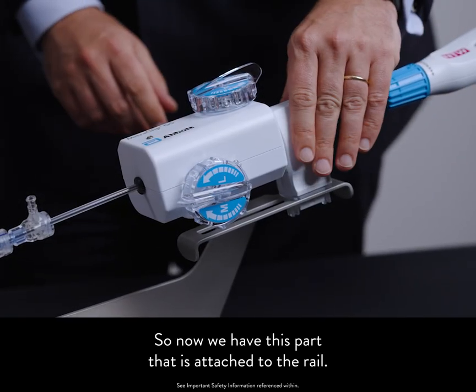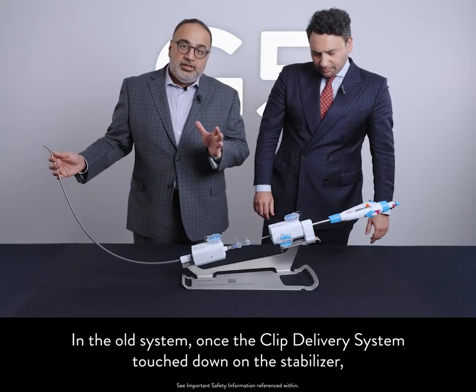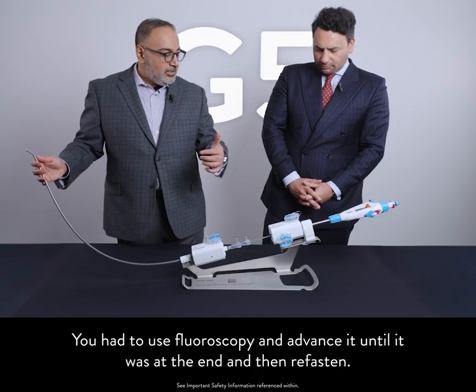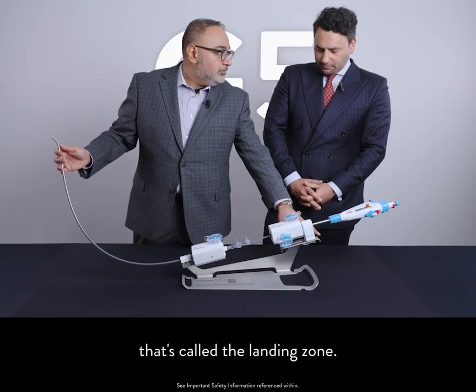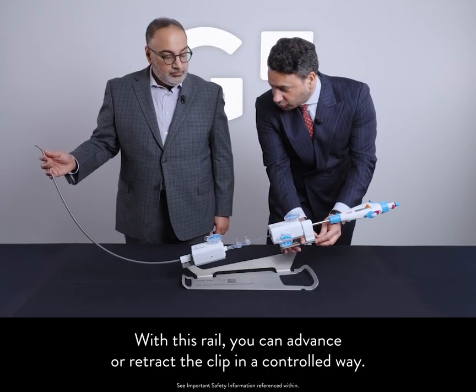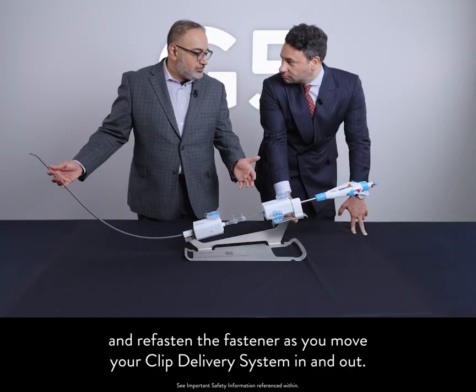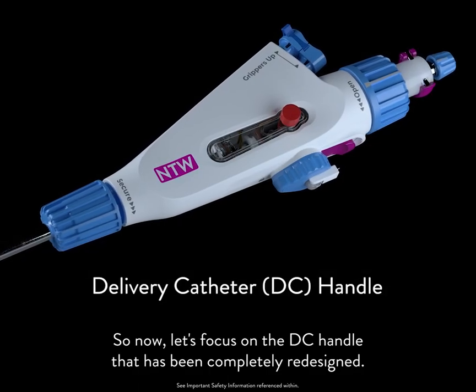Now we have this part that is attached to the rail. What does it mean when you attach the system to the rail? In the old system, once the clip delivery system touched down on the stabilizer, you had no idea how close you were to the end. You had to use fluoroscopy and advance it until it was at the end, then refasten. With the new system, as soon as you're at the beginning of the rail — that's called the landing zone — once you touch down here, you're automatically at the tip of the guide. With this rail, you can advance and retract the clip in a controlled way, and you don't have to unfasten and refasten the fastener as you move your clip delivery system in and out.